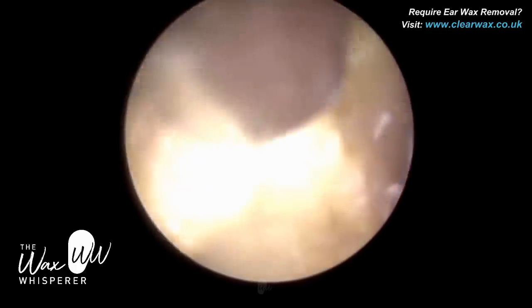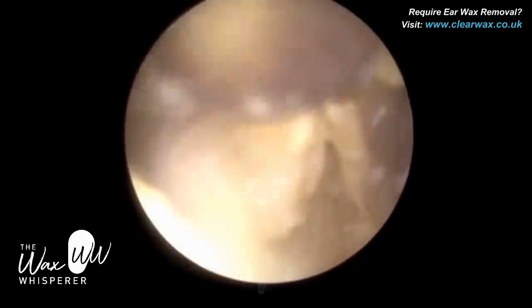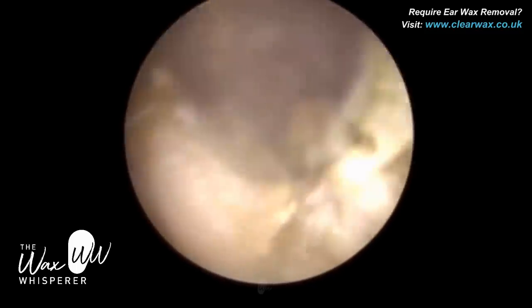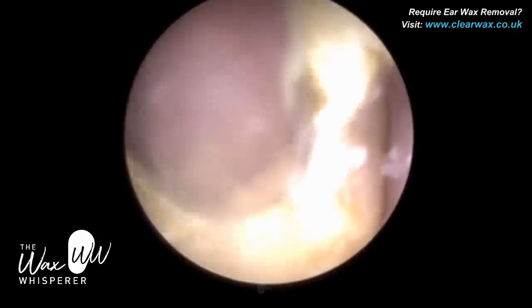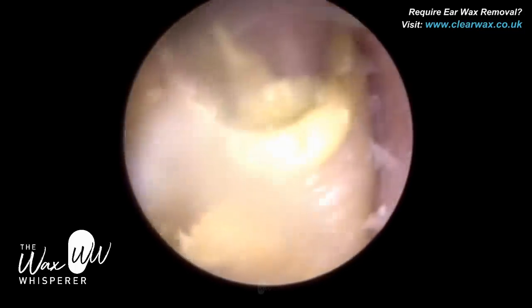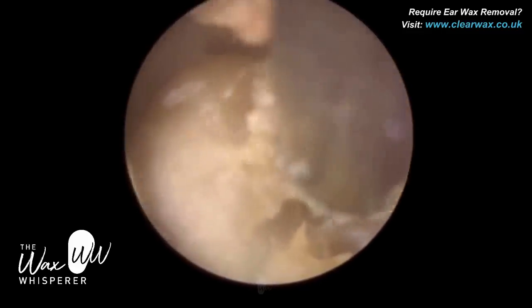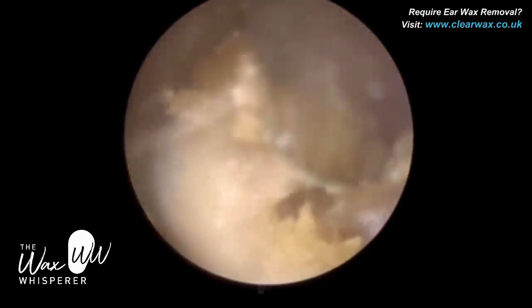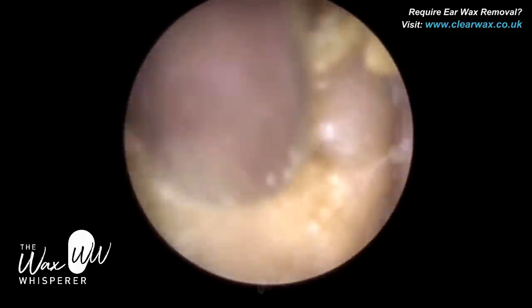You can see how mushy this wax is. I'm just using microsuction with the standard Zonar suction probe, and what I'm trying to do is elevate and retract this wax off the canal wall. Quite often with earwax, we have a layer of keratin — dead skin — that envelopes the wax, but it's also adhered to the ear canal. Dead keratin is similar to double-sided sticky tape: the inside bit sticks to the wax, and the outer part of the keratin is still adhered to the ear canal wall.